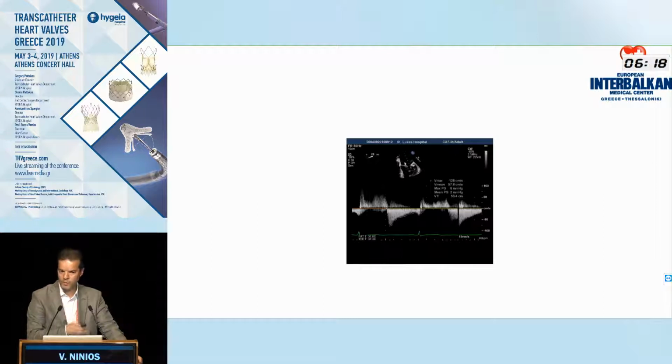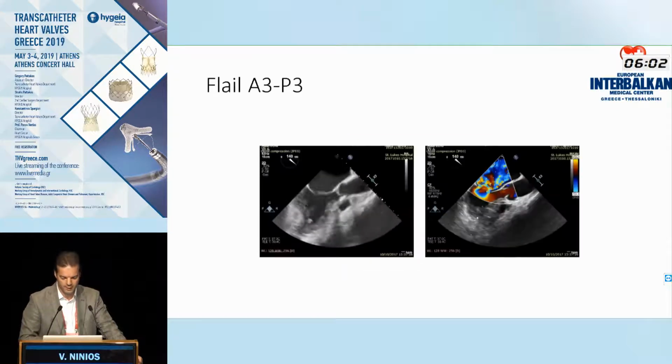Now, this is not always easy to achieve, and sometimes you may not be able to be accurate when you put the clip, but you have to try. Clearly, this is a situation that the second clip is out of the question, because there's limited space and the calcium is your enemy here.